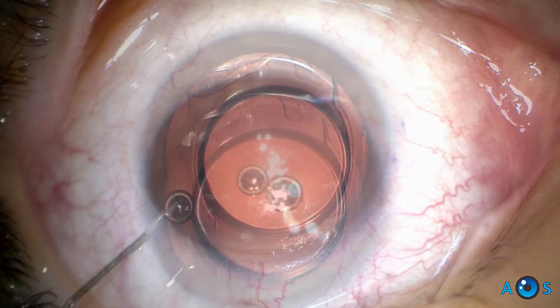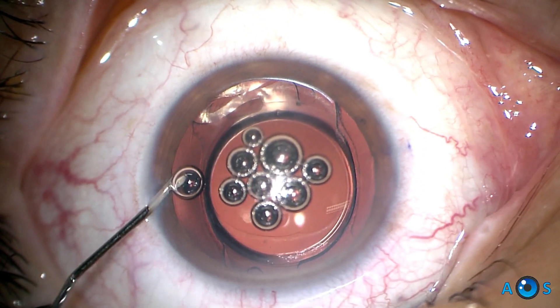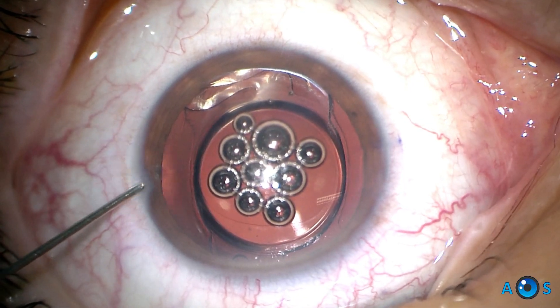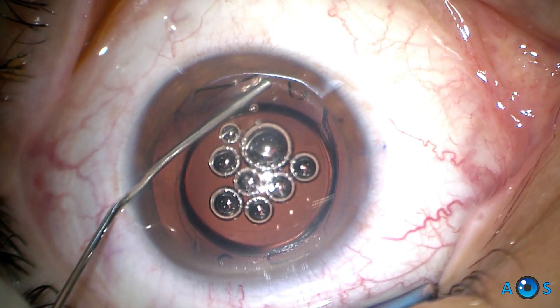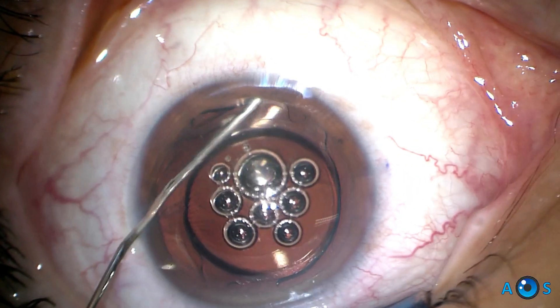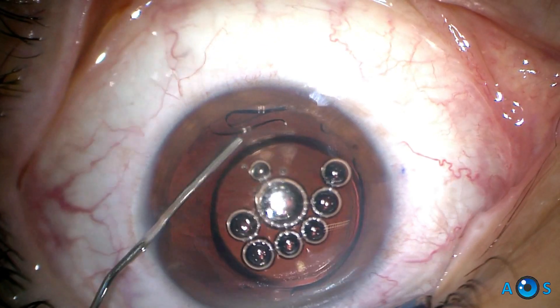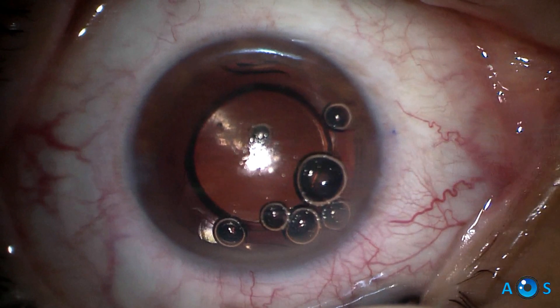The first step is to inject dispersive OVD to coat the corneal endothelium. Notice that we introduce a few air bubbles intentionally — these will act as visual indicators for maneuvers in close proximity to the endothelium. Then, cohesive OVD is injected to create space in the anterior chamber, as well as to gently loosen the IOL from the capsular bag.